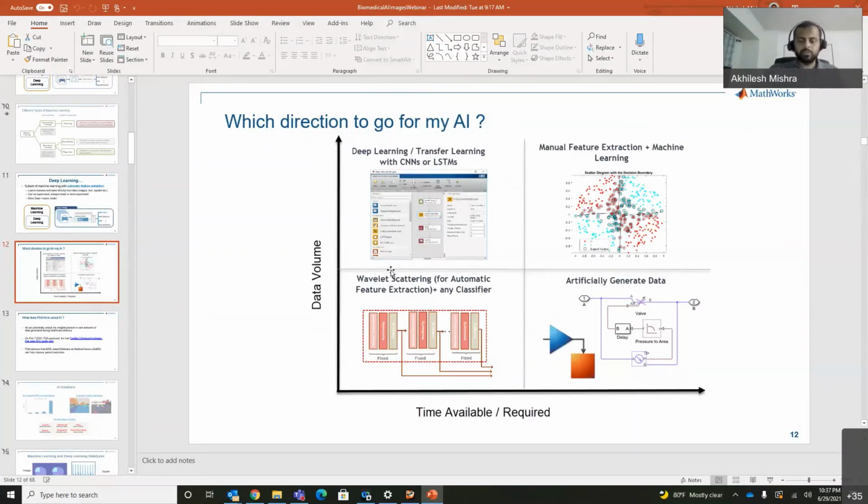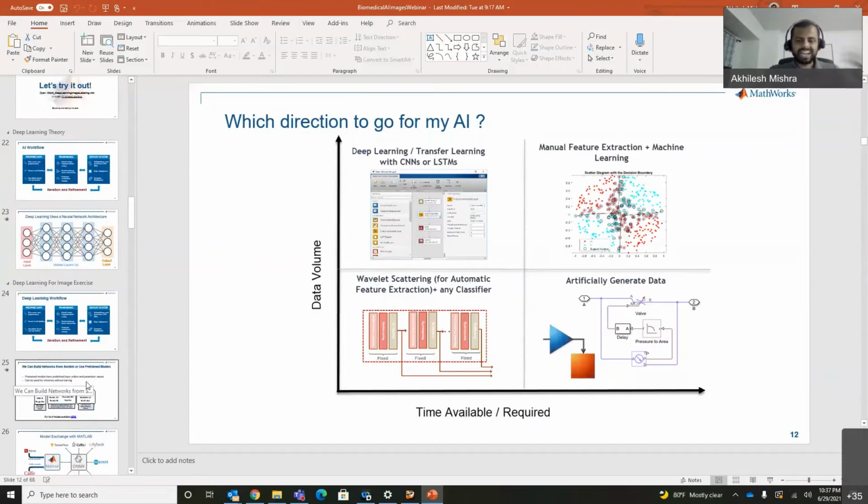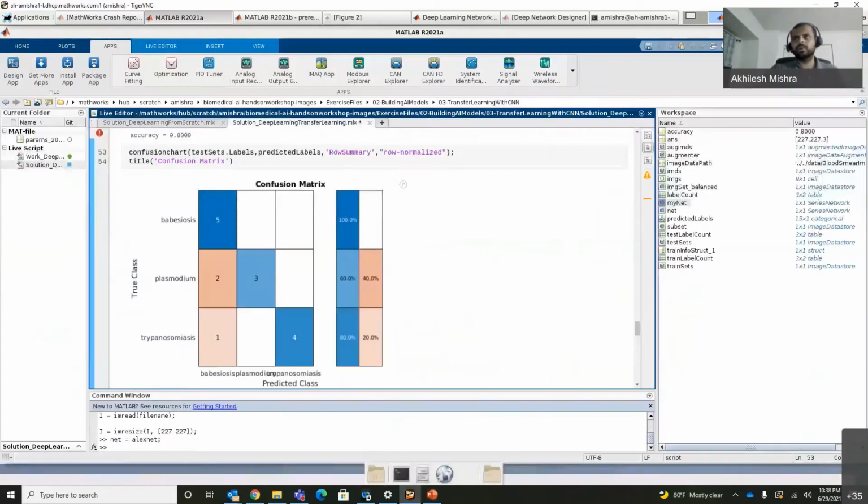So it's pretty easy to use, but I would like to open the floor to questions before I go into the more practical approach, using this part over here, where we can train any classifier and get a much higher accuracy. And the speed of the network would also be pretty phenomenal. So any questions at this point, I would just like to take them right now.